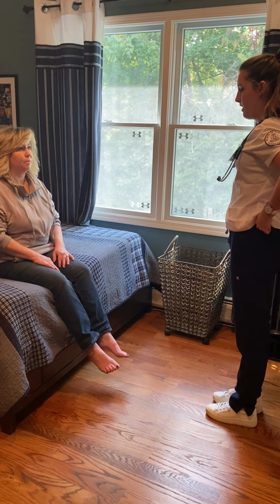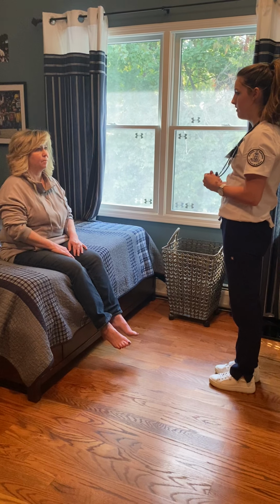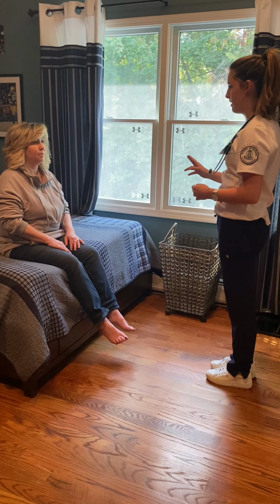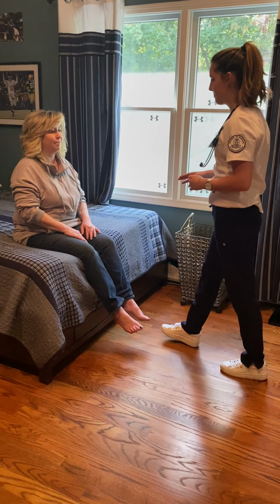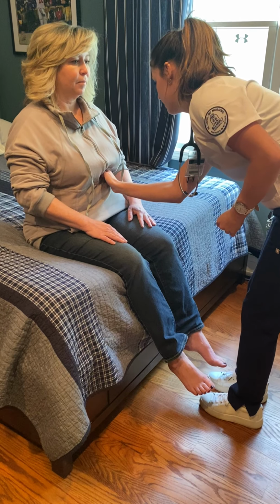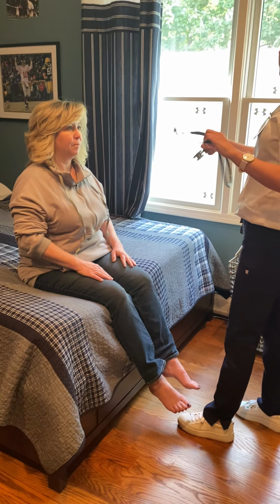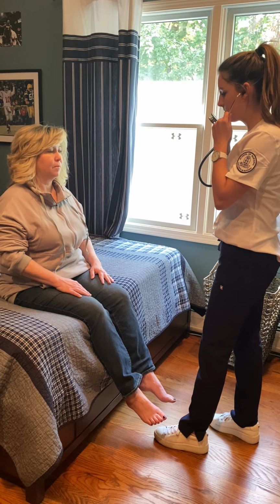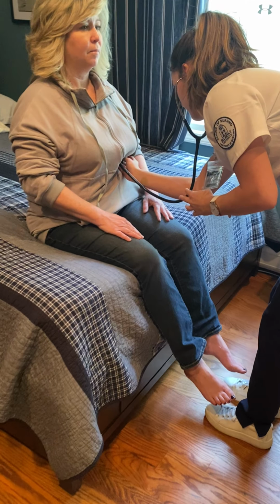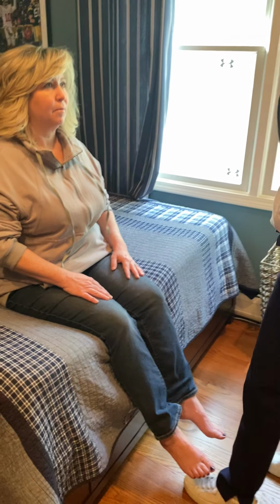So now I am going to be assessing your apical pulse. So your apical pulse is going to be in the 5th intercostal space in the left midclavicular line. So first I'm going to find it with my hands and then I'm going to listen to it. So here. Okay, now I'm going to listen to the apical pulse. Okay, apical pulse is 2+ and regular.